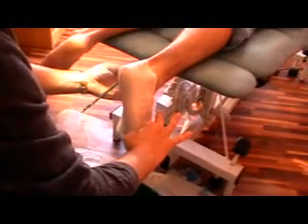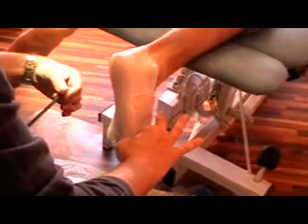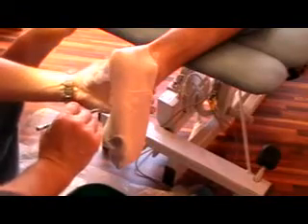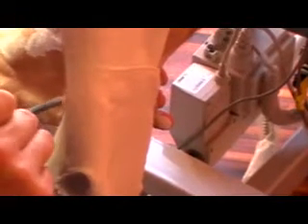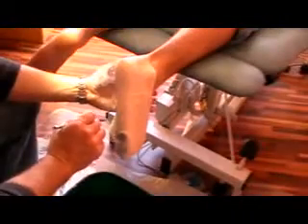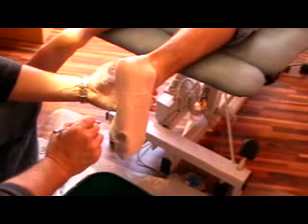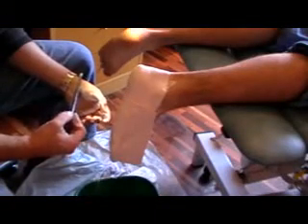You can check when the cast is set by tapping it with a pencil — when it's not set, it makes a dull sound. At this stage, it's vital to record your patient's name on the bottom of the cast. Putting your patient's name on the cast at this stage avoids any confusion with other casts. Another sound test confirms that the cast is ready to come off.